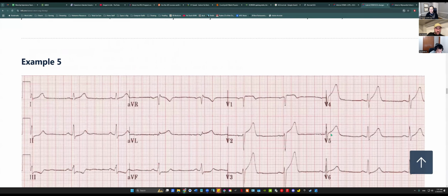I'm going to make this a little bit easier for you to read. Okay. So elevation, and anterior. So I'm going to say lead one. Top left, like V1 or one? So one, it looks like, because if we're looking at our baseline, it is slightly elevated. Two looks fine. Can I scroll down at all?